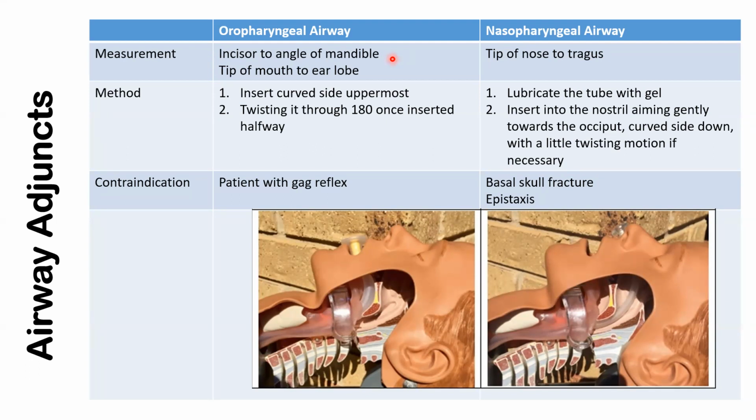So it is contraindicated in patients that have a gag reflex. A conscious patient, you cannot put this in, because it will cause the patient to gag, subsequently vomit, and aspirate. So don't use it in a patient with a gag reflex.